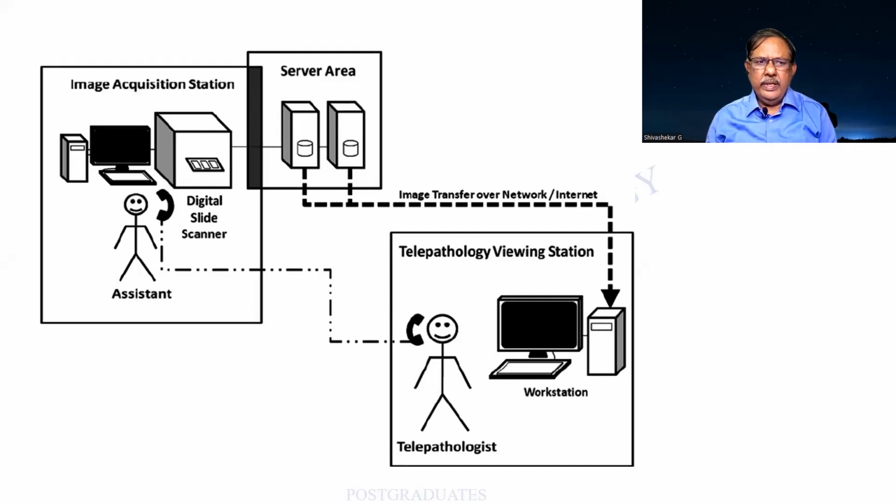So this is the simplicity I meant. There is someone over here who is managing to screen a slide and then feed it onto a system, from where it goes to a server area and is transmitted to another place where another person studies it. And finally, the opinion or the information goes back. It need not be restricted to pathology. There is something called telepathology, but then there is also teleradiology and teledermatology.